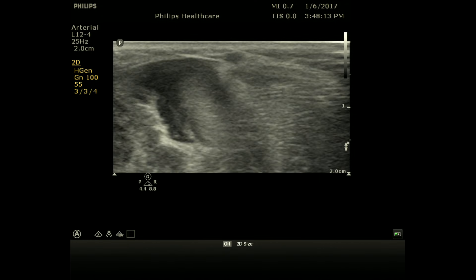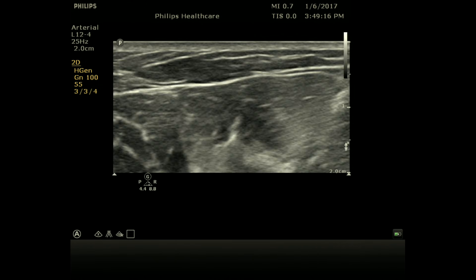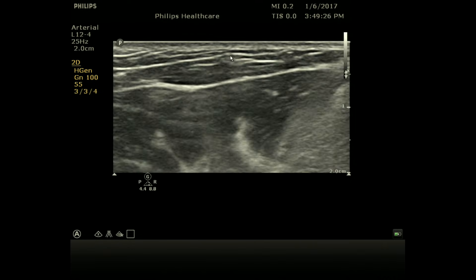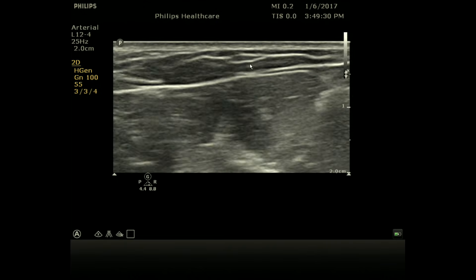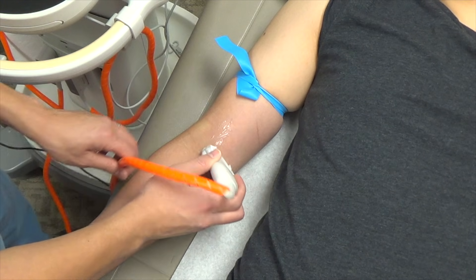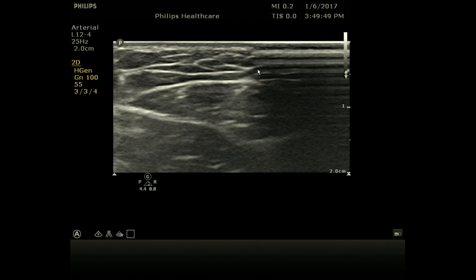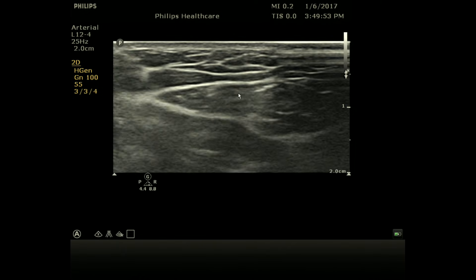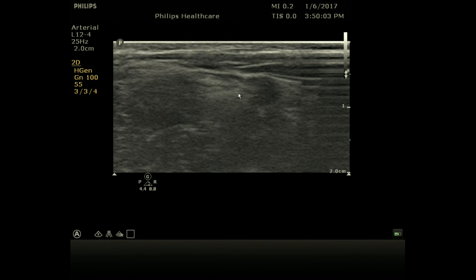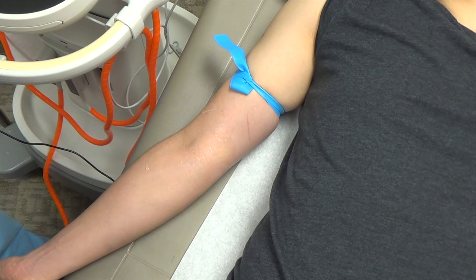You can also slide the probe laterally or medially to look for smaller veins. Moving laterally, you can find the cephalic vein — here's an example of a very superficial cephalic vein that you can still cannulate. In a patient with lots of edema you won't see it on physical exam, but you'll easily see it on ultrasound. Moving more medially, you can sometimes find the basilic vein, which is also a peripheral vein suitable for cannulation. In general, try to avoid the deep brachial vein, as that's where PICC lines and midlines are placed — a basilic or cephalic vein is ideal.